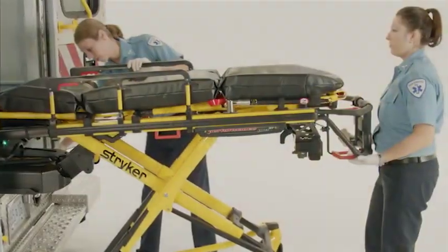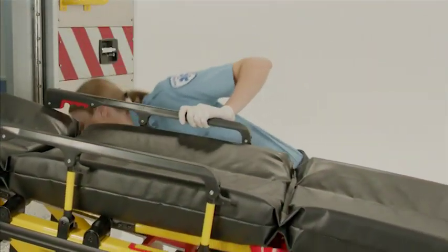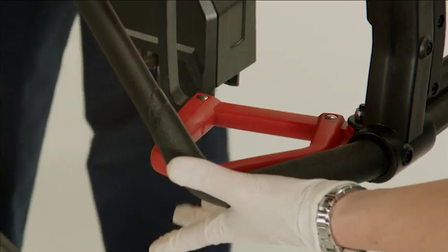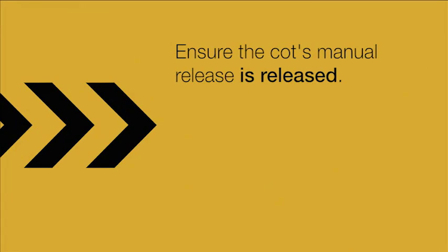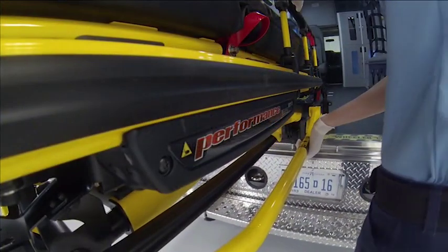The foot-end operator will now grasp the cot frame at the foot-end and squeeze and hold the manual release on the cot. The side operator stabilizes the cot with one hand and retracts the undercarriage with the other. Release the cot's manual release to lock the undercarriage in the retracted position. Ensure that the cot's manual release is released. If it is not released, the cot base will extend, preventing the cot from locking in the fastener.